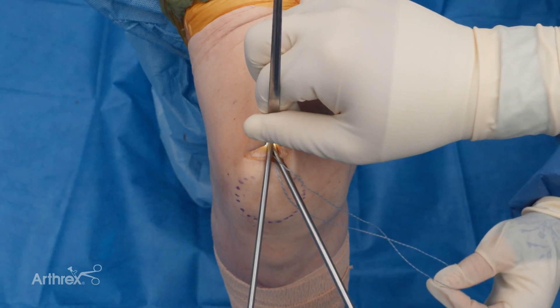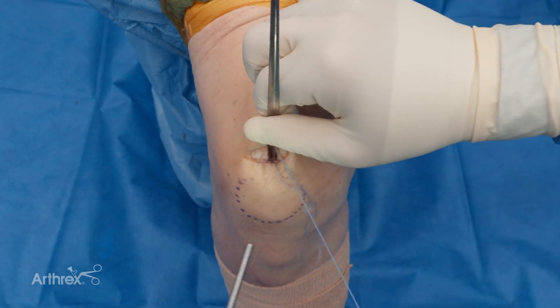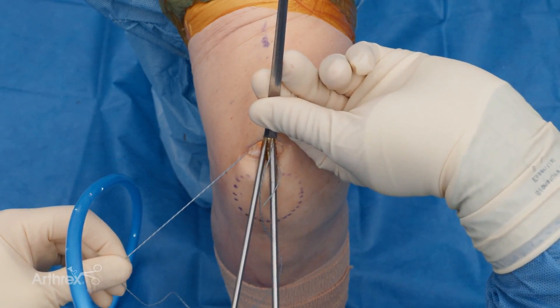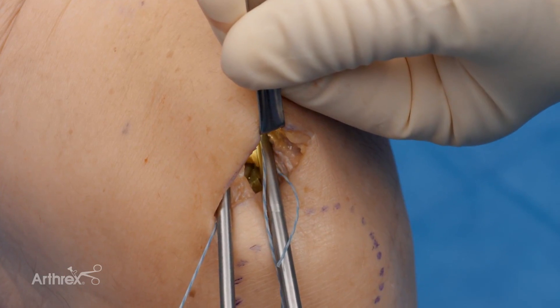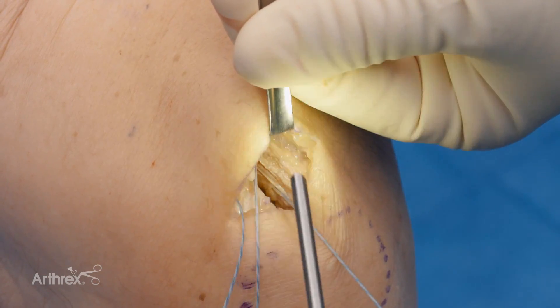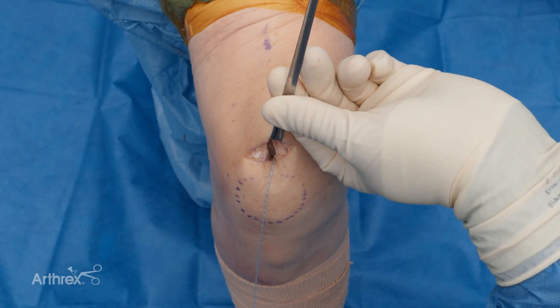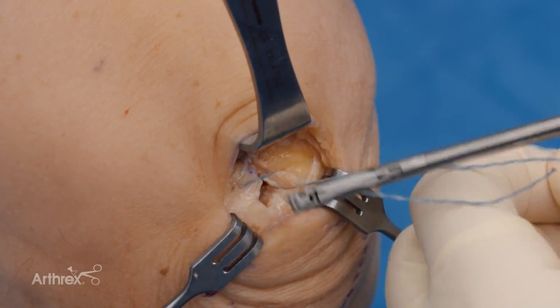You can see now we're coming in with our third bite — I like that. We're coming in once again with the scorpion inverted for our next pass. Now we're getting pretty close to our incision openings where I can actually really see well through the open incision. You'll just go back and forth with a standard pass and an inverted pass. And now my last one on this side.